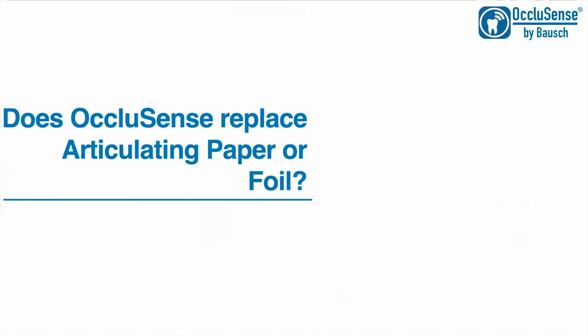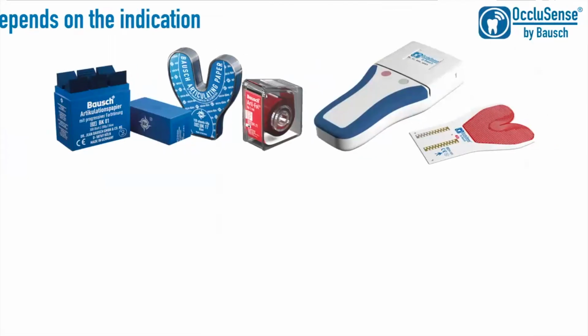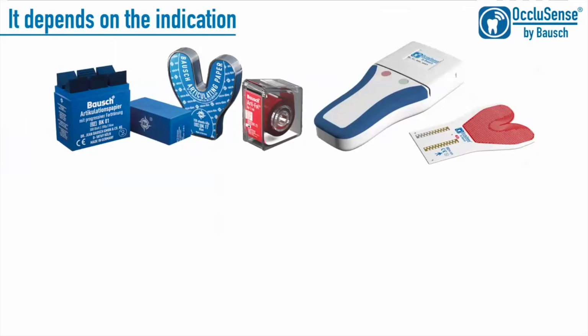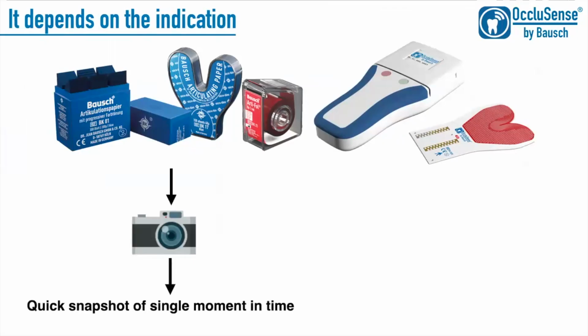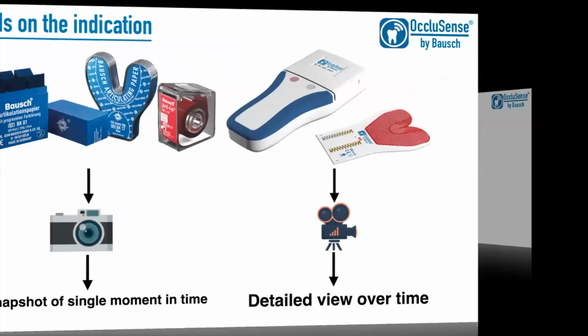The most relevant question maybe for today, does OccluSense replace the articulating paper or foil entirely? I would say it really depends on the indication. So the algorithm that I suggest is, if you need a snapshot of one moment in time, you use your papers and foils. If you're looking at a complete overview of the three-dimensional process of occlusion and you need more a video of that moment, then you use OccluSense.